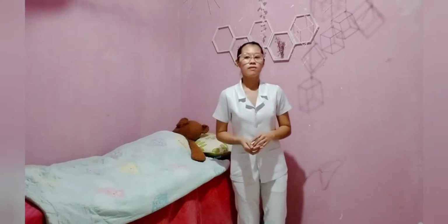Okay, thank you. And after that, record the time the procedure was done, the amount, and the color of the initial output. Cleansing the environment promotes comfort to the client. Moisture is a good environment for bacterial growth. So, the time right now is 2:30 p.m. and the initial color of the urine is slightly yellow with cloudy characteristics. That's all. Thank you.